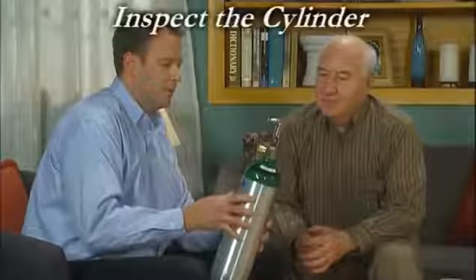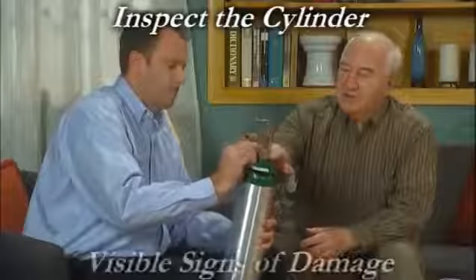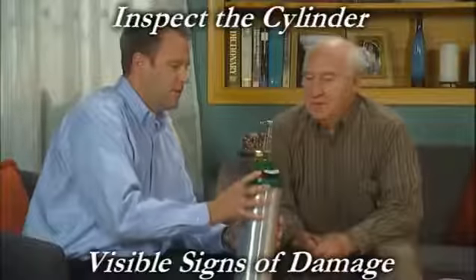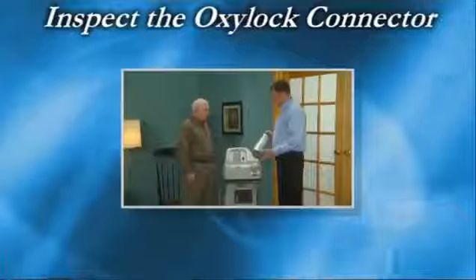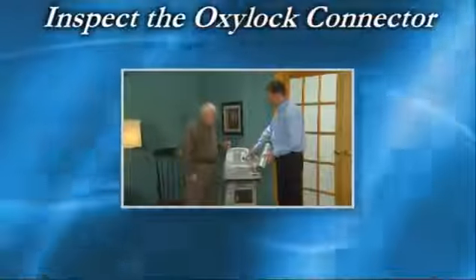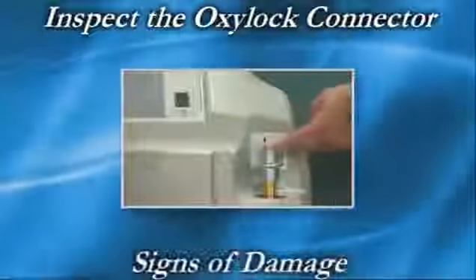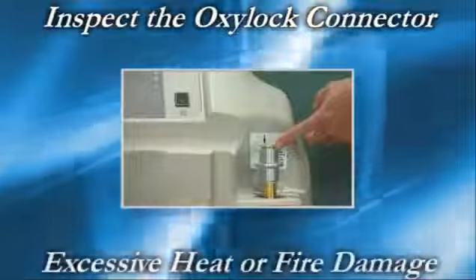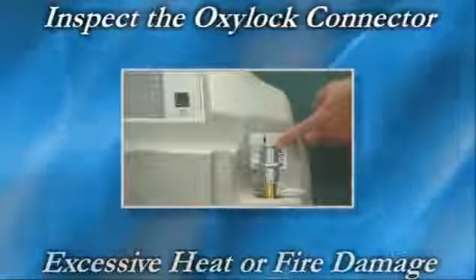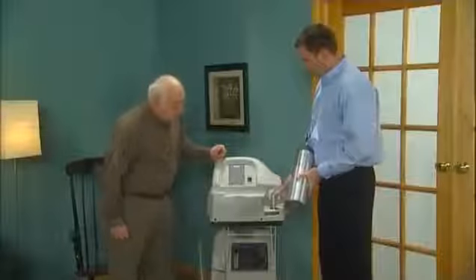Before connecting the cylinder to the home fill compressor, inspect the cylinder for dents, arc burns, oil or grease, or any other visible signs of damage. If it is damaged, do not use the cylinder and contact your provider. Next, inspect the home fill oxylock connector for debris, oils or grease, noticeable signs of damage, signs of corrosion inside the valve, or signs of excessive heat or fire damage. If any of these conditions are evident, contact your provider and do not fill any cylinders.